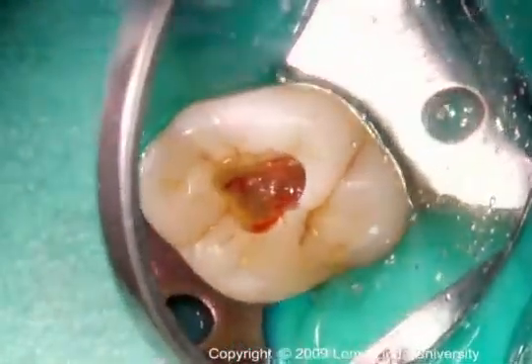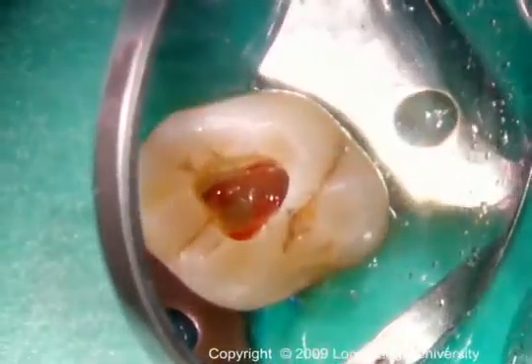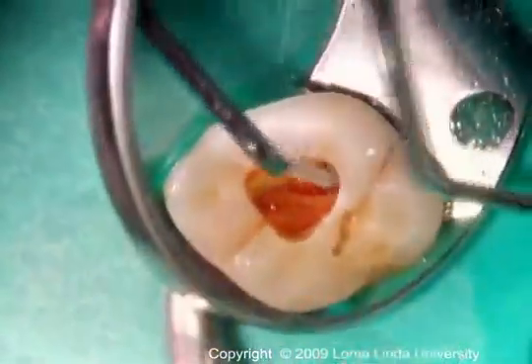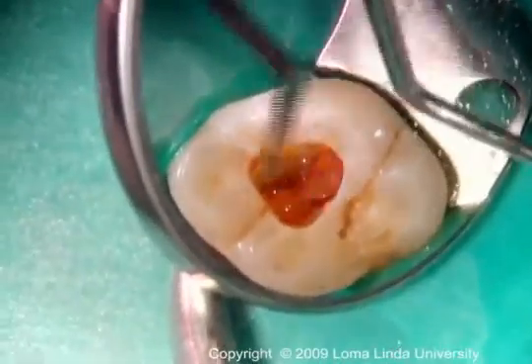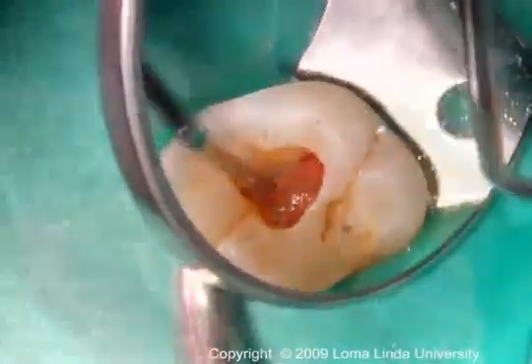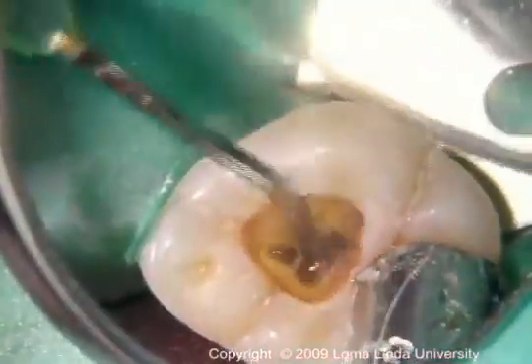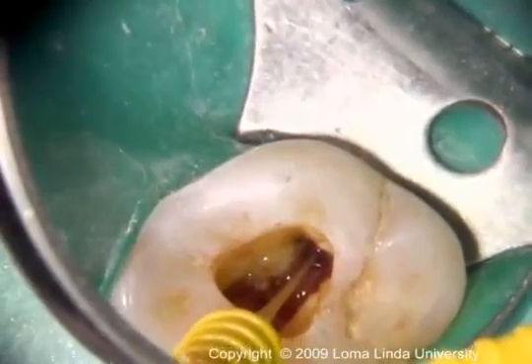A large pulp stone is found on the floor of the pulp chamber of this tooth. With the use of a spoon excavator or an endodontic explorer, the pulp stone is removed. The pulp chamber is irrigated with sodium hypochlorite and the pulps are removed using barbed brooches.